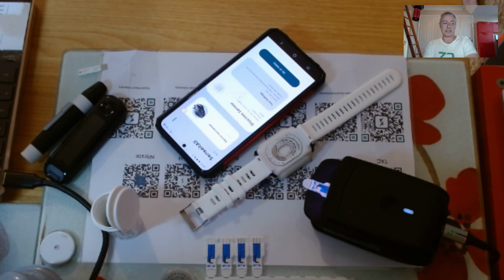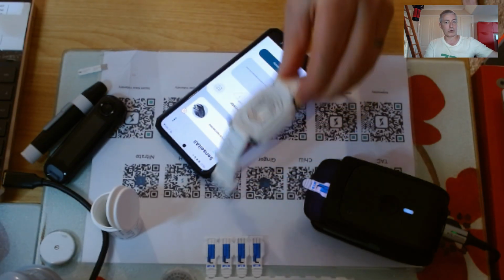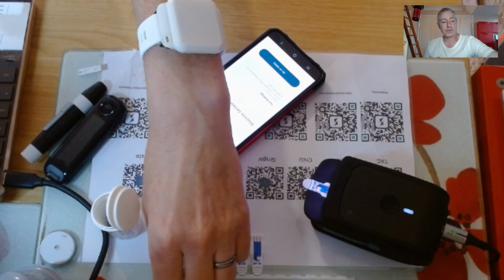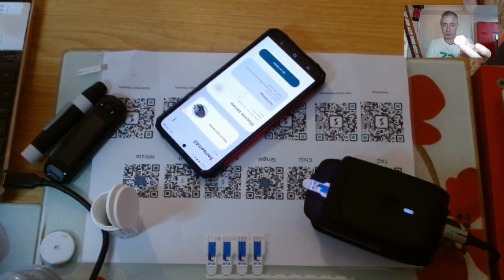So the question is, let's say I had a wristwatch like this, and it's microneedle, this one is, so it goes through the skin. It doesn't require an applicator. You can just pull it through the skin like that. The question is, will it need calibration? Now, the quick answer is, if you look at Dexcom or Abbott, when these products first came out, they absolutely required a finger stick test during the first 24 hours. Only later on did they become calibration free.